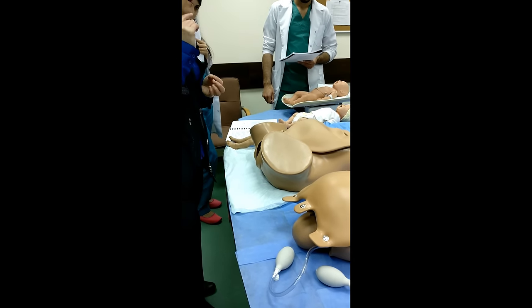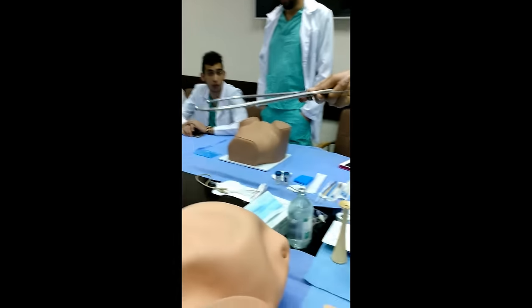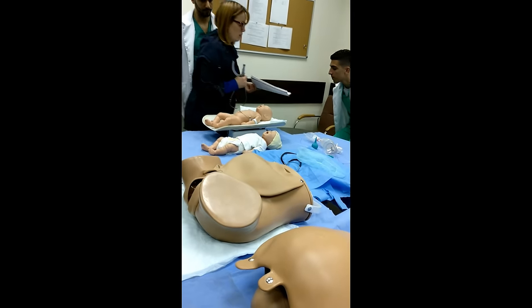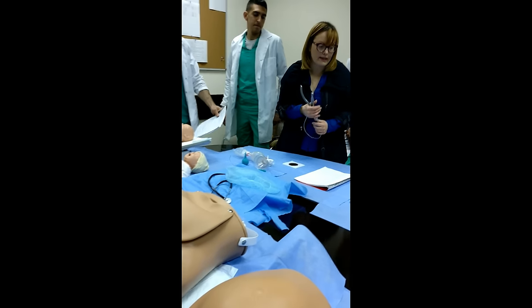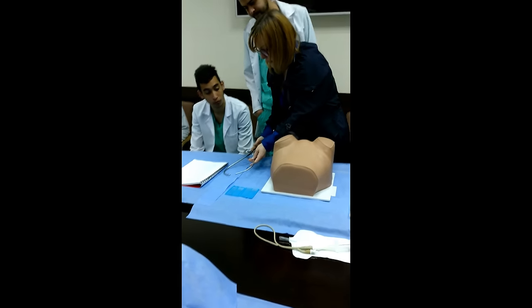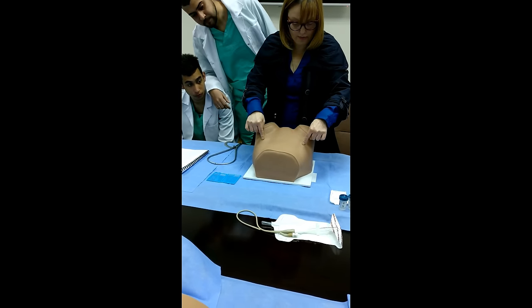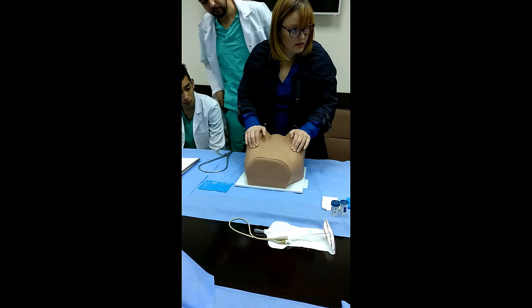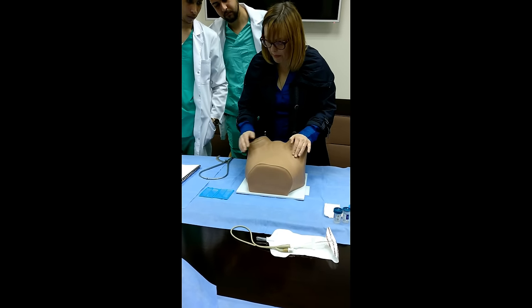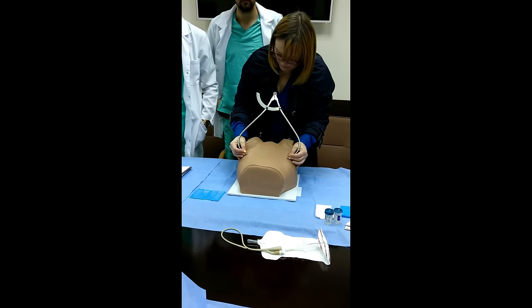For external pelvimetry, we use a pelvimeter, and that mannequin is the best one to perform the procedure because you can detect the points easily. Which diameters do we measure with the pelvimeter? Interspinal, between the spines. So we palpate the anterior superior iliac spines, and after that we apply the pelvimeter.